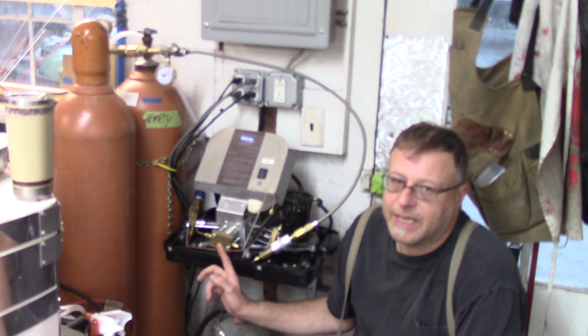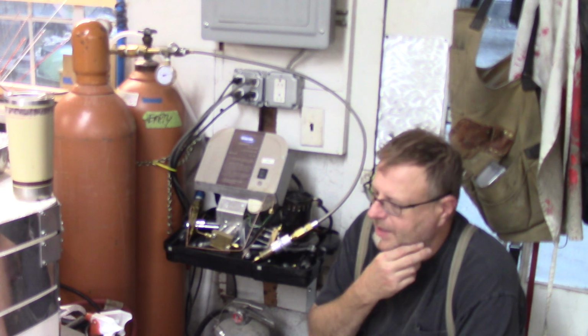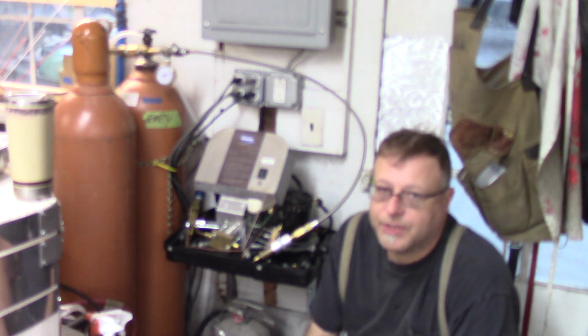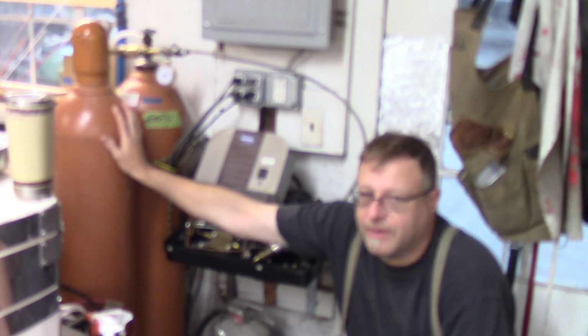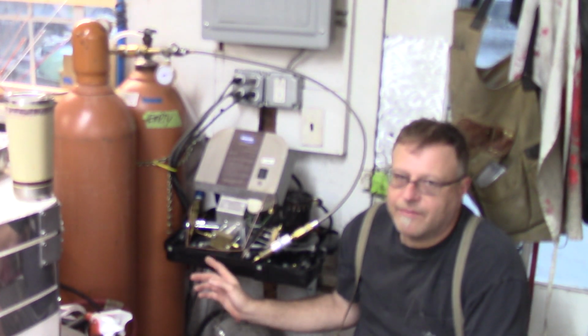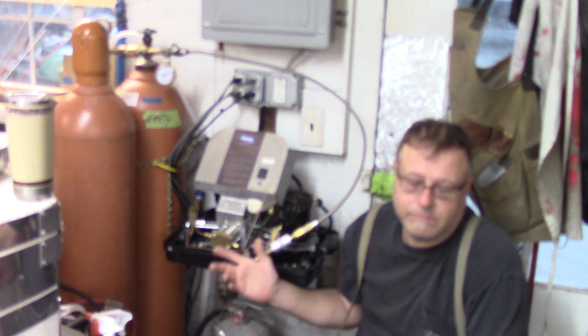Before I purchased this, I did about half the amount of research that I should have. And one of the things that I read was that you're not supposed to run more than 1,000 psi in one of these 250 cubic foot bottles. Why is that? Well, these machines were never designed or intended to run for 36 hours straight. They just weren't.